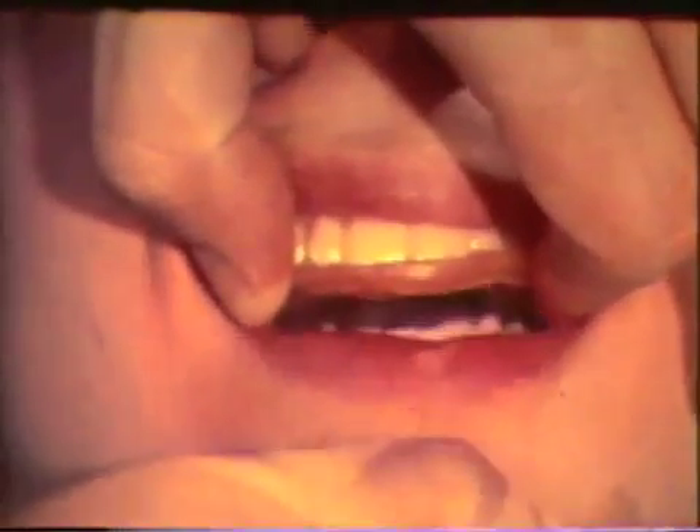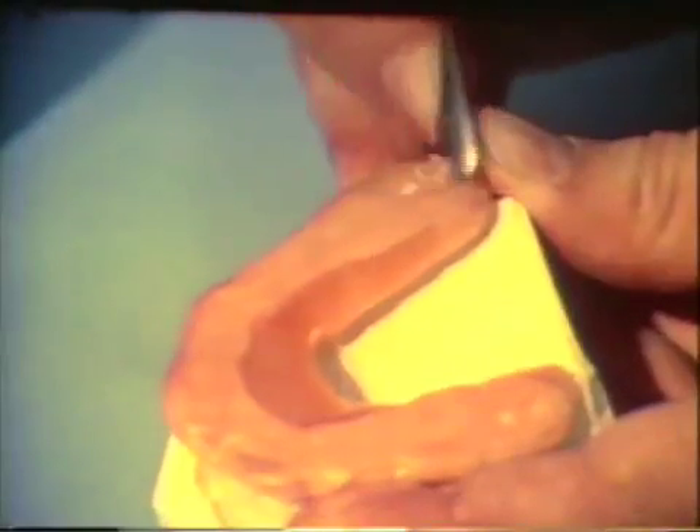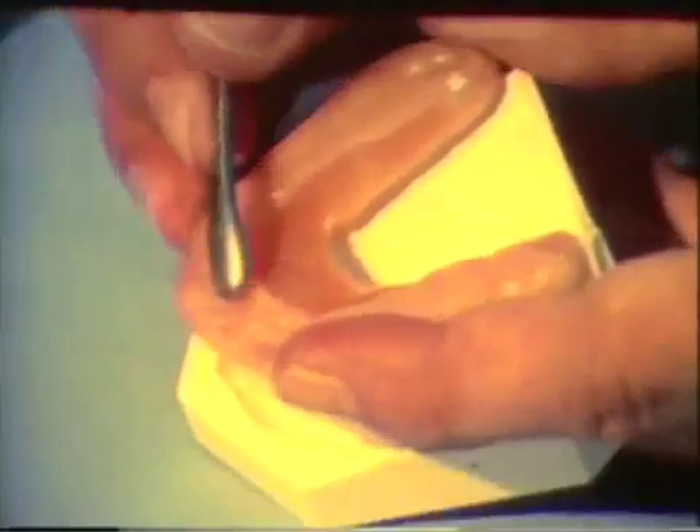The revised wax pattern is tried in the mouth. The mandible is tapped against the wax in centric relation. The unsoftened molar parts of the wax pattern will maintain vertical dimension. Inspect the occlusal surface of the wax and note the areas of heavy imprints in the second molar areas. The occlusal surface is trimmed down to the depth of the imprints in both the second molar area and the palatal anterior region.